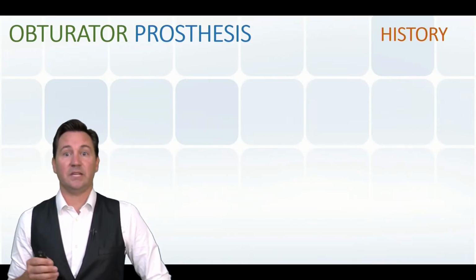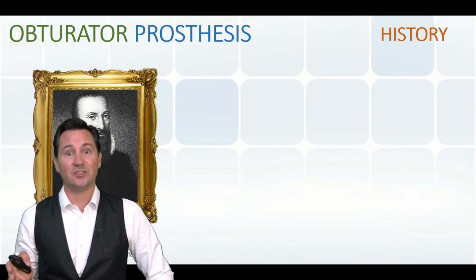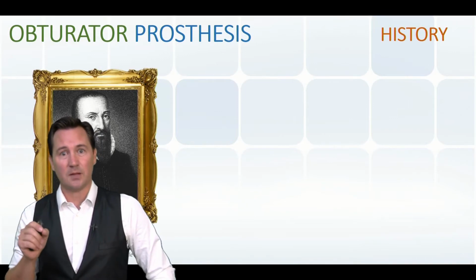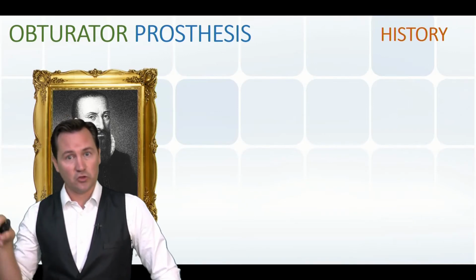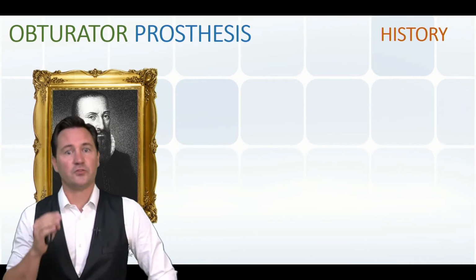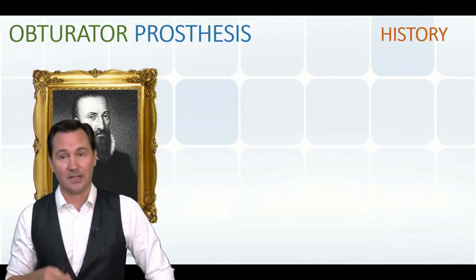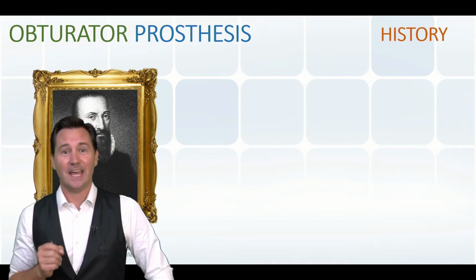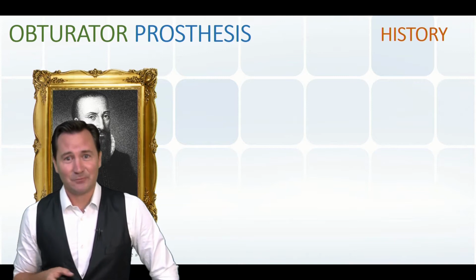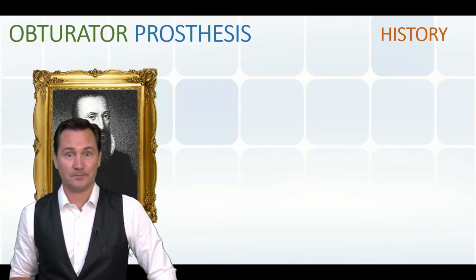Various obturators have been developed over the ages. Briefly, although it existed before Ambroise Paré, he was the first to precisely describe a golden device with a sponge and to call it an obturator. Another big step was the first surgical obturator described by Claude Martin in 1875. And as you can see, I have a very French vision of history. This palatal prosthesis evolved very slowly until the ones we're about to talk about.